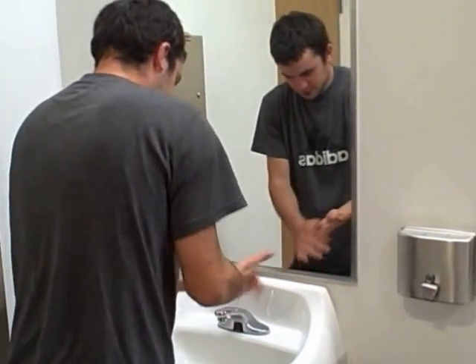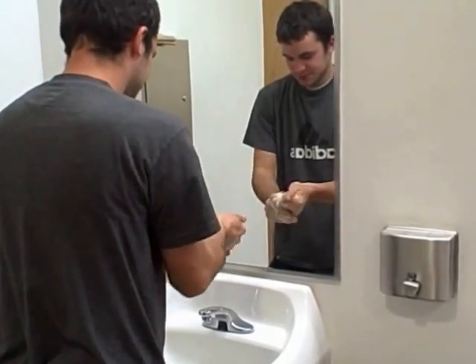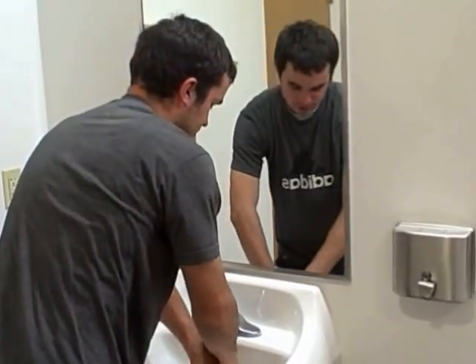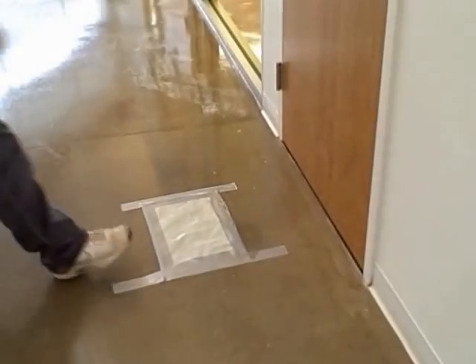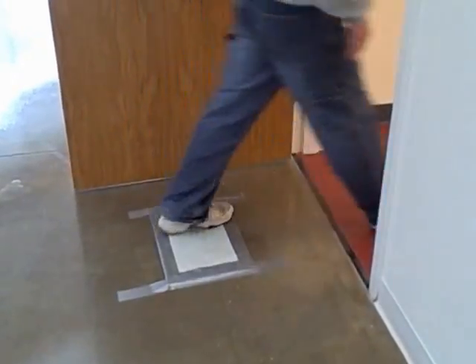Wash your hands for a full 30 seconds with unscented soap and water before entering the gown room. Step onto the sticky mat to remove any extra dirt or dust that may be on your shoes.